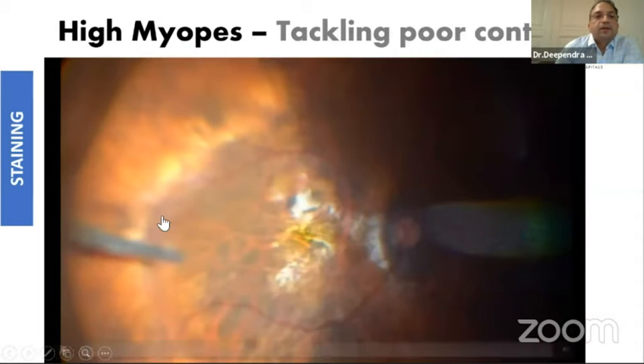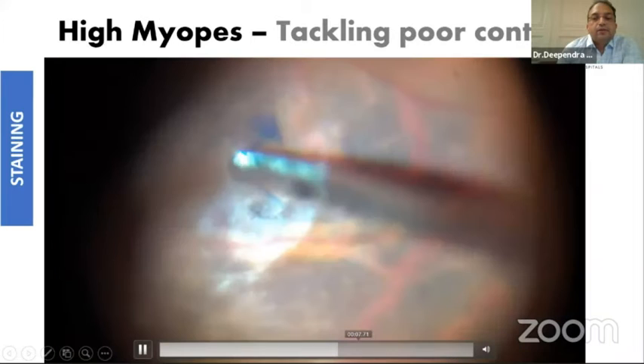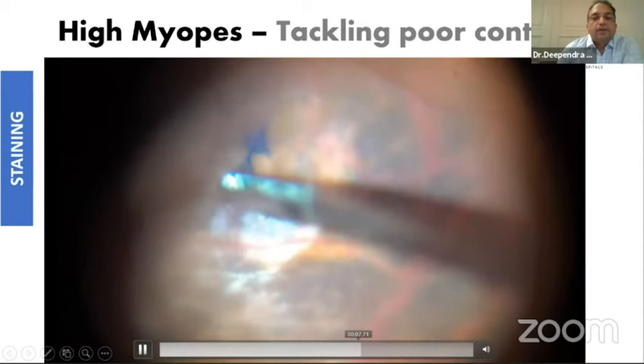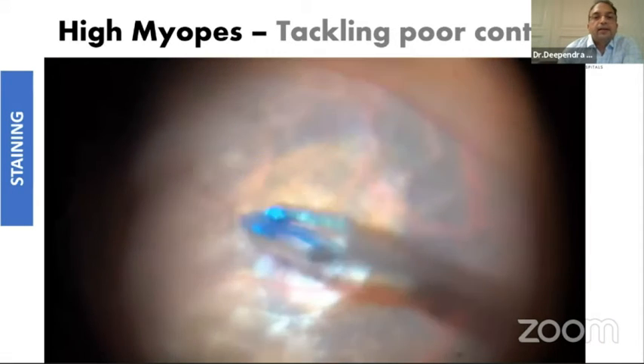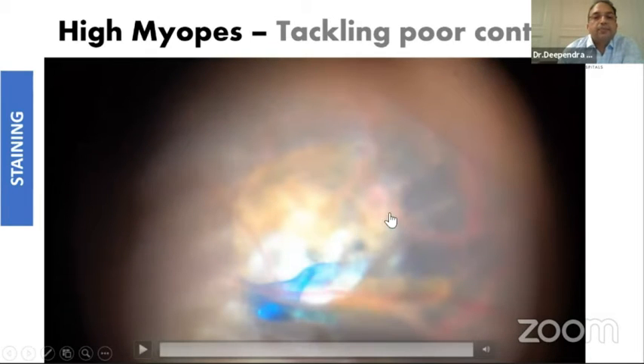In high myopes, sometimes the contrast is not good and even when you stain it looks like you are not able to see as well as in emmetropic eyes. The trick here is to start the peeling — you create a small naked ILM — and the moment you get your flap, the flap is very nicely visible against the background of the white atrophic areas.